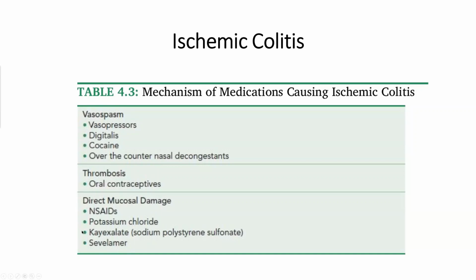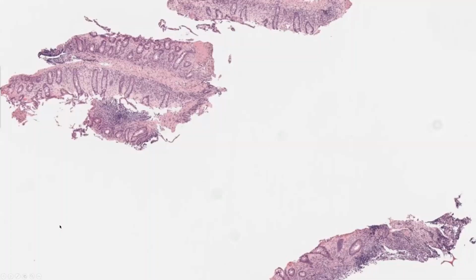So I just wanted to show you an example of ischemic colitis just to highlight this. And while we are in this area of surface epithelium stripping, which we saw in previous examples, I just wanted to show you that example as well. I have two questions for you at this power. The first: do you think the surface epithelium is stripped? Yes or no? The second: do you think that the lamina propria is inflamed or not? Yes or no?